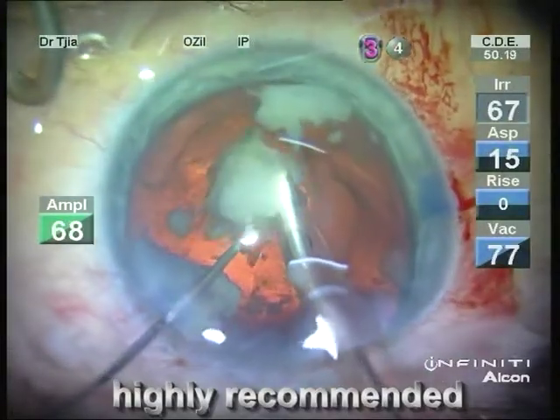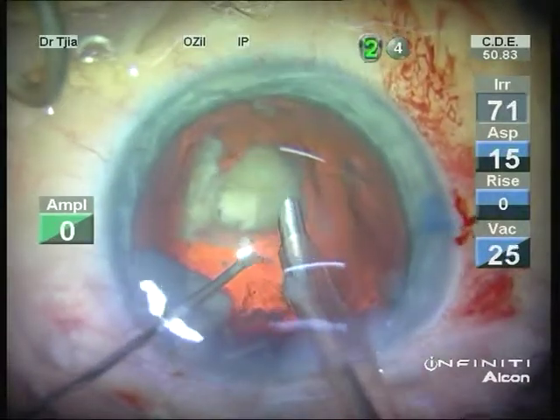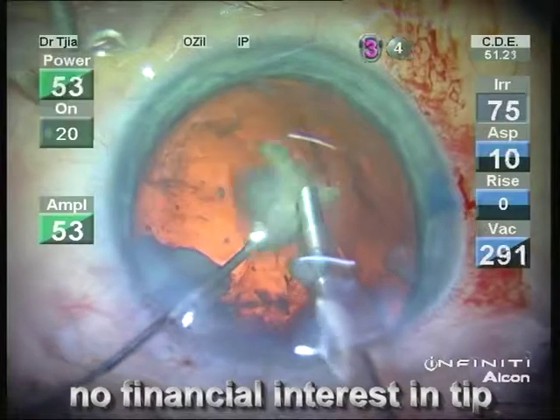I highly recommend the new 0.9 mini tip for torsional FACO, and I have to mention that I have no financial interest in this tip.